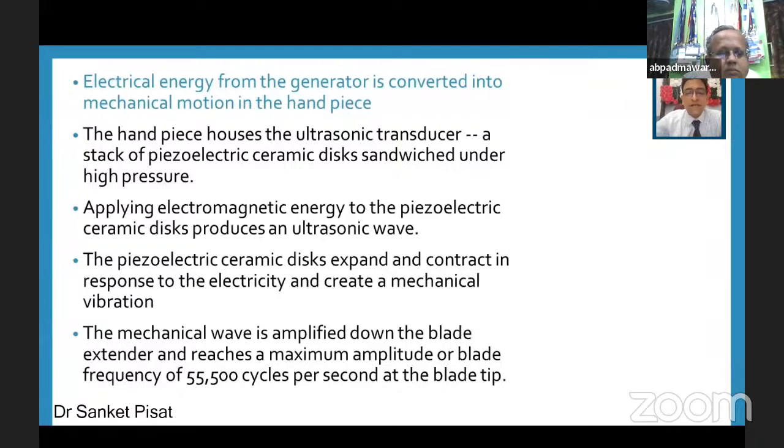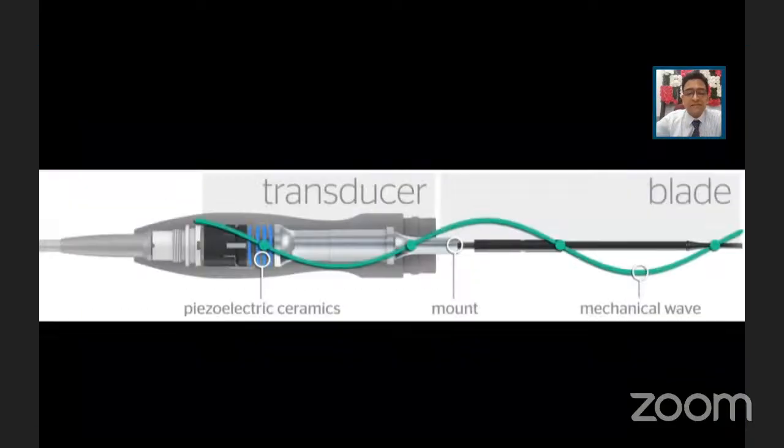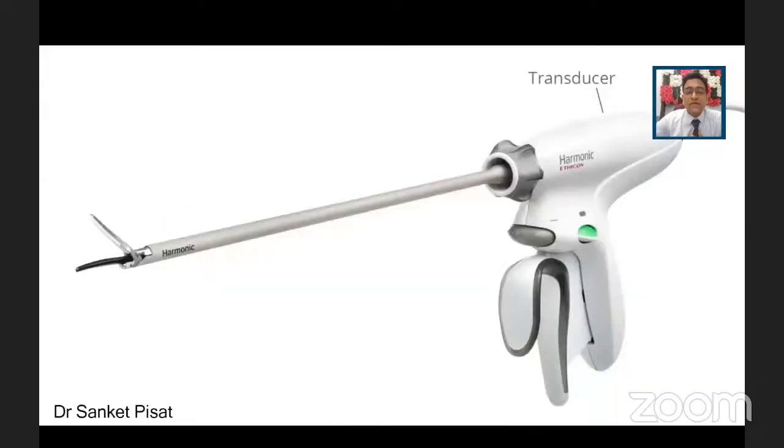So let's see how that works. Once the blade is activated, these are the piezoelectric crystals over here. The electricity comes in from here. This stimulation causes movement of the piezoelectric crystals, and the harmonic wave is initiated, and this wave passes as a vibrational wave to the hand instrument and then to the patient. Notice again that there is no electricity flowing into the patient at all. So this was the transducer that I talked about. In most instruments, this will be found as a separate silver colored cable that is attached to the back of the instrument, and in some it may be integrated as well. So this is the transducer.